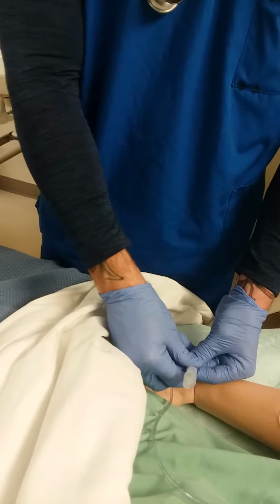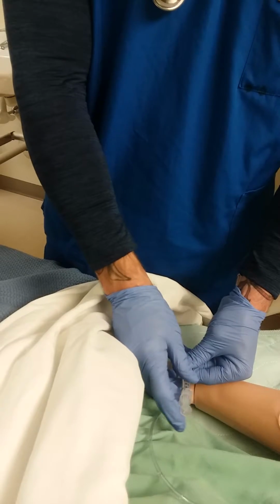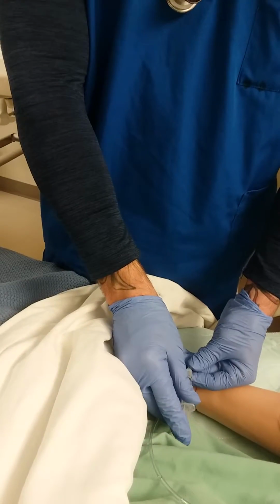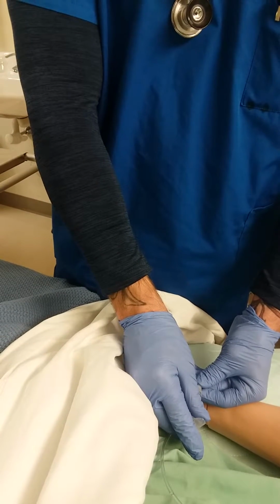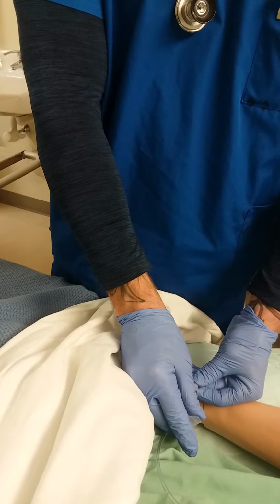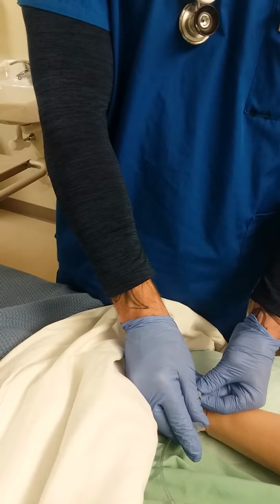and we're attaching the syringe. So once again, the rate for this medication is going to be 6 seconds per line. So I'm using my watch. Then I'm going to inject at 6 seconds for every line. It's going to be a very, very slow, continuous push, and it should take a minute to administer.